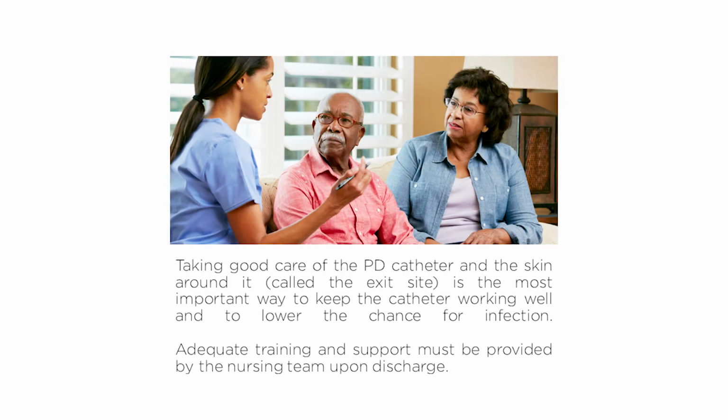Taking good care of the PD catheter and the skin around it, as we call it the exit site, is the most important way to keep the catheter working well and to lower the chance for infection. Adequate training and support must be provided by the nursing team upon discharge.